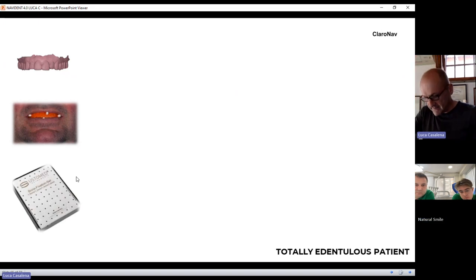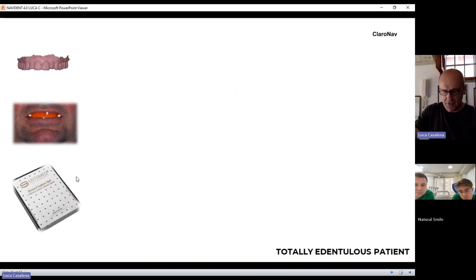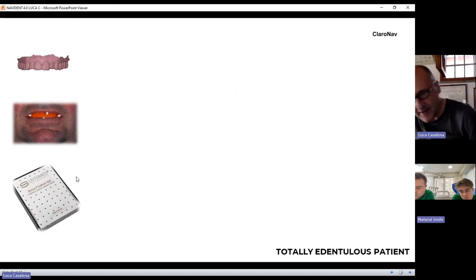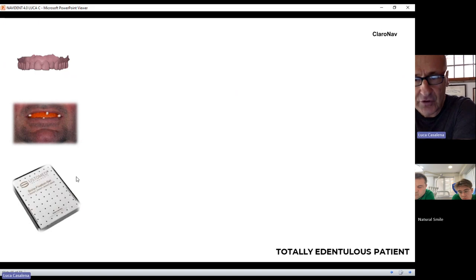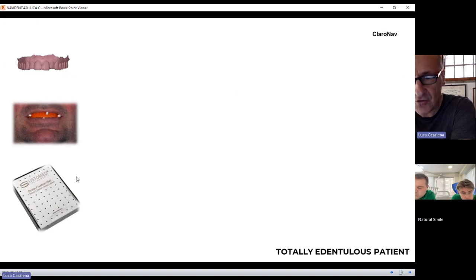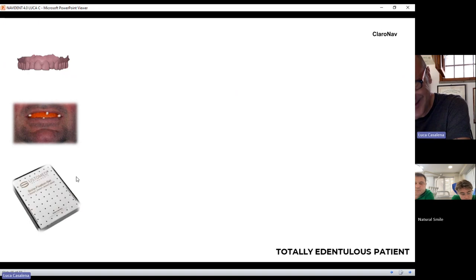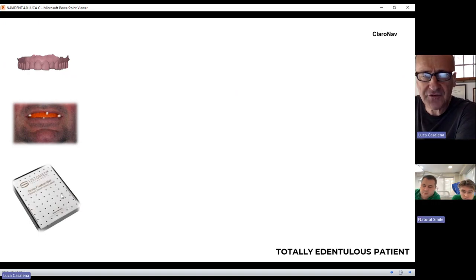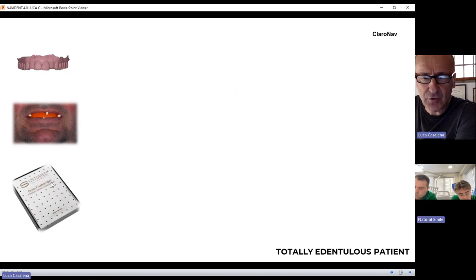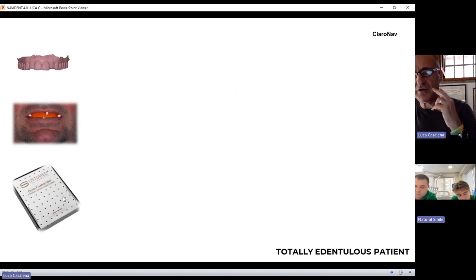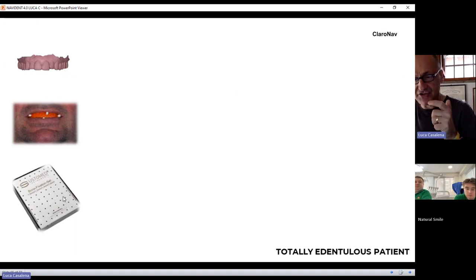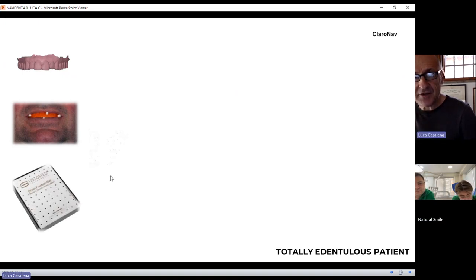Then you have this surgical kit — the Eustomed kit. It's not mandatory to use Eustomed, but Eustomed has the advantage of being fully recognized by Navident. These mini screws are bone fixation screws, and you're going to place a minimum of four — two on each semi-arch, two on the left and two on the right. With this preparation, the patient gets scanned.